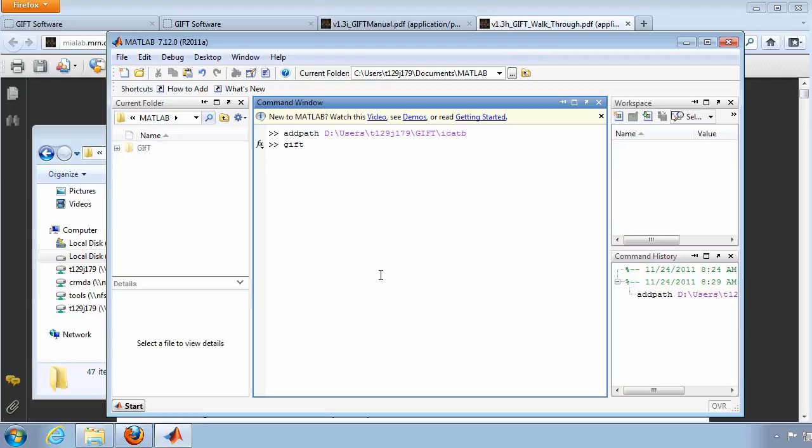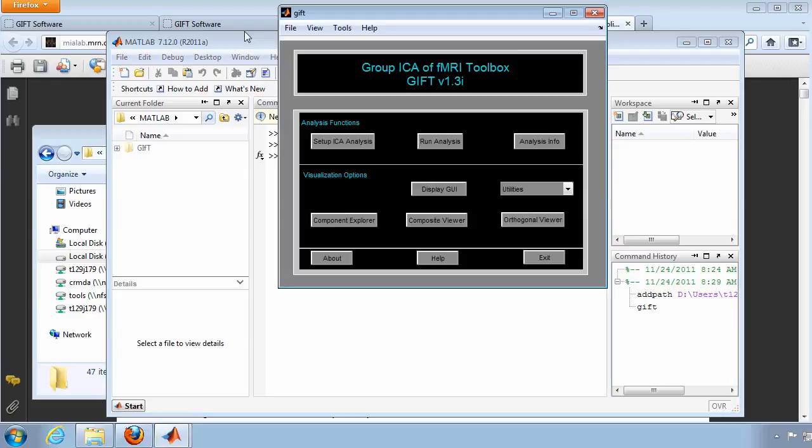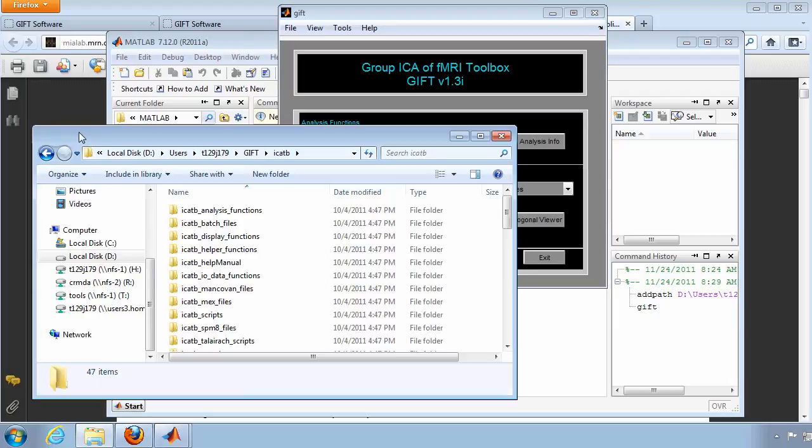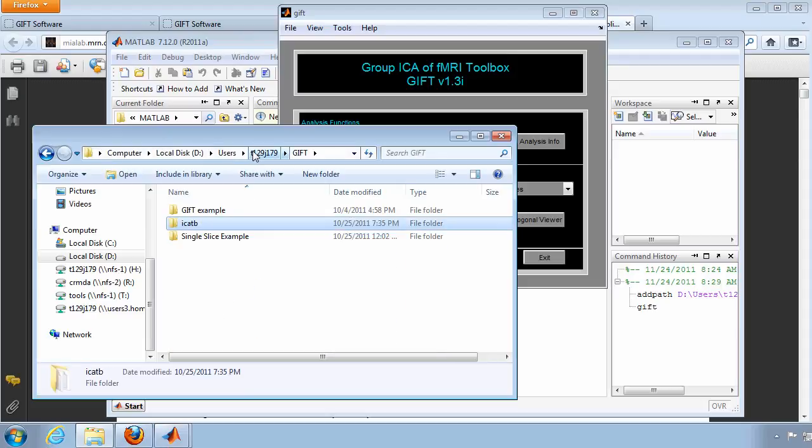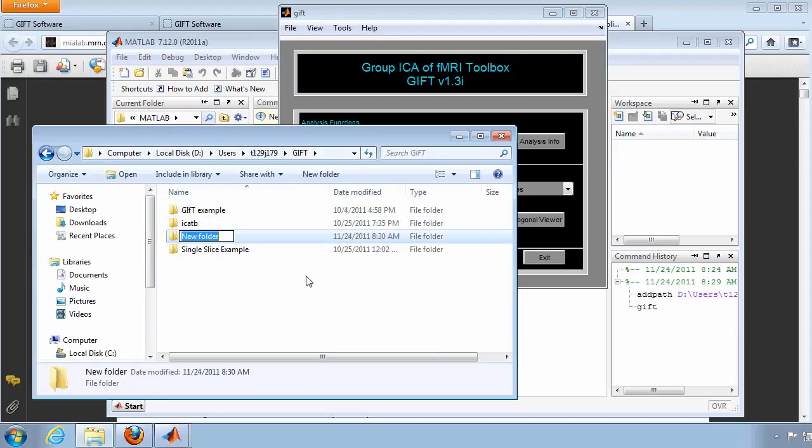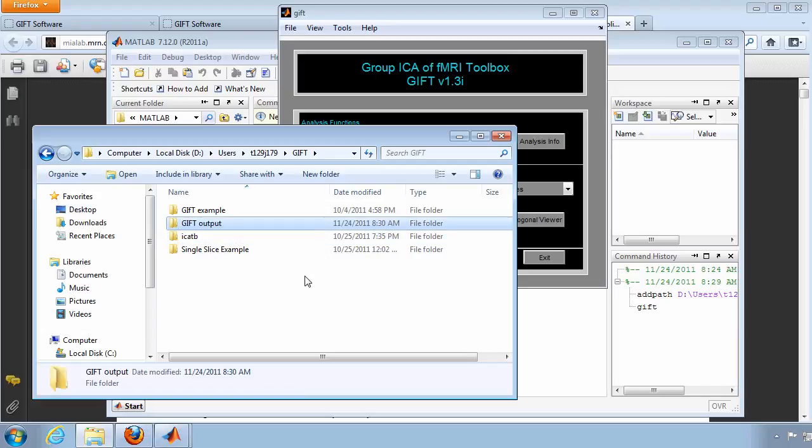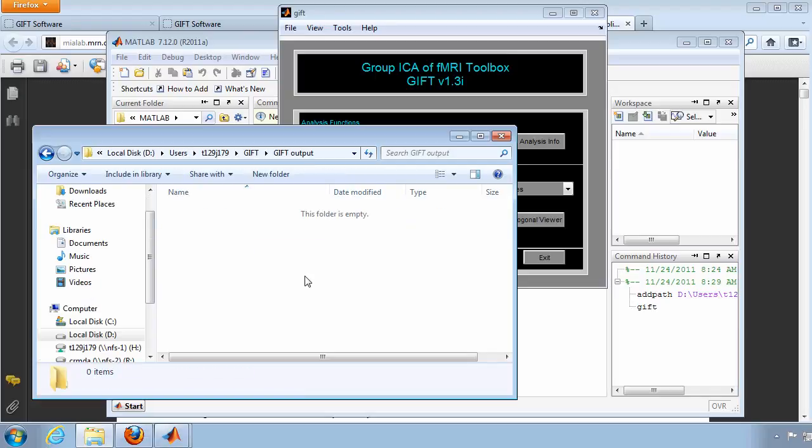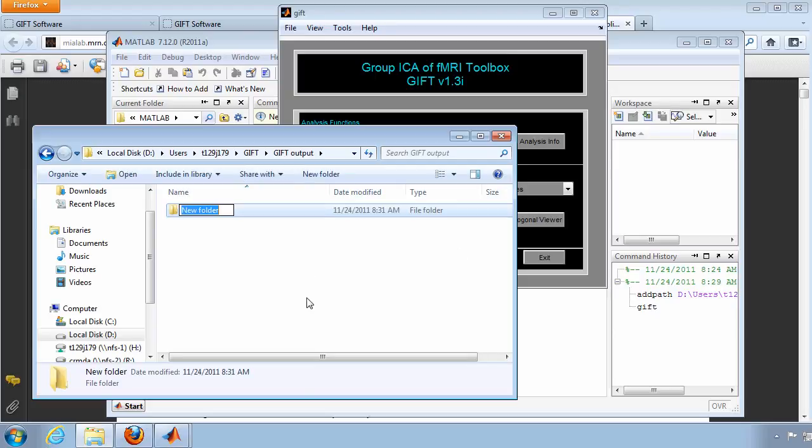Now that MATLAB knows where to find GIFT, type GIFT in the command window and press ENTER. The GUI or graphical user interface for GIFT will now appear. Before you begin, create a folder where you can store your output. Because you may choose to analyze the data more than once using different parameters, create a sensible naming convention for the subfolders within the output folder.